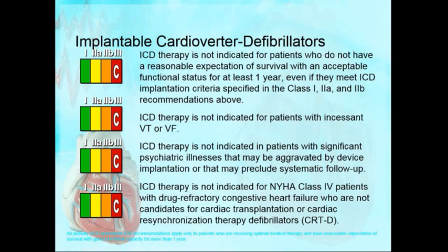On a principle level, if you don't feel comfortable, you don't have to do it. So I will always turn off the defibrillator with the patient's wishes, but I will never turn off the pacemaker. That's me. For exam purposes, you can do both. They will not ask you a pacemaker question for sure. That is above internal medicine level. But a defibrillator question is very legitimate.